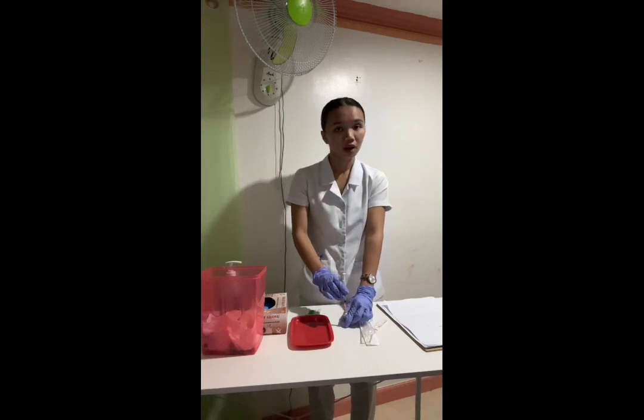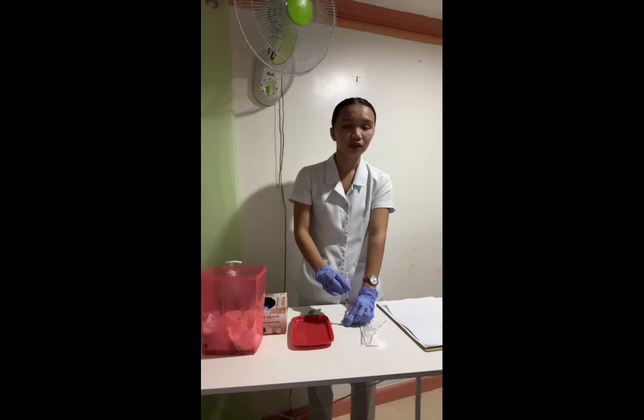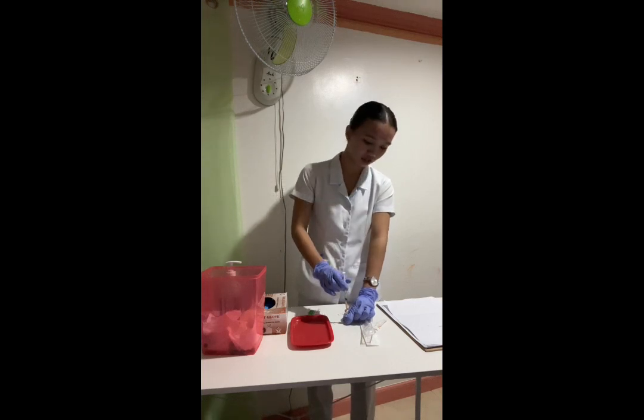And then we are going to withdraw the prescribed amount of medication using either of the following methods. Either we hold the vial down with the base lower than the top, and then move the needle tip so that it is below the fluid level and withdraw the medication, because keeping the vial in the upright position while withdrawing the medication allows particulate matter to precipitate out of the solution. The next technique is to invert the vial, ensuring the needle tip is below the fluid level and gradually withdrawing the medication, because this will prevent air from being drawn into the syringe.